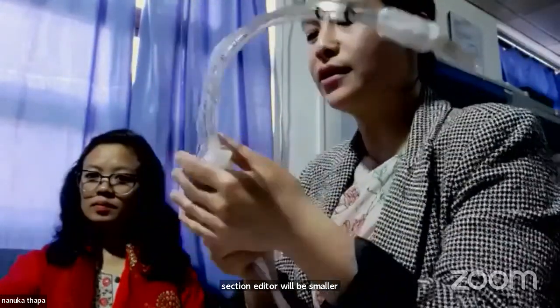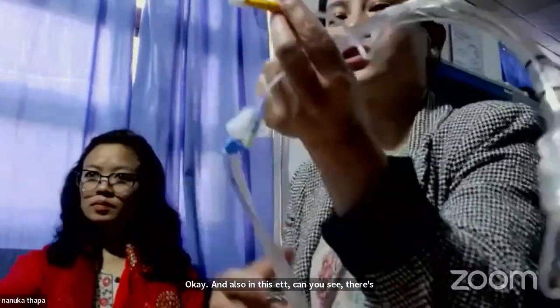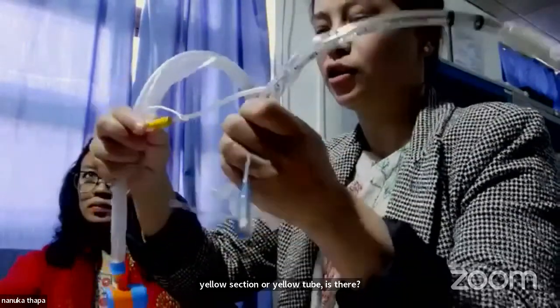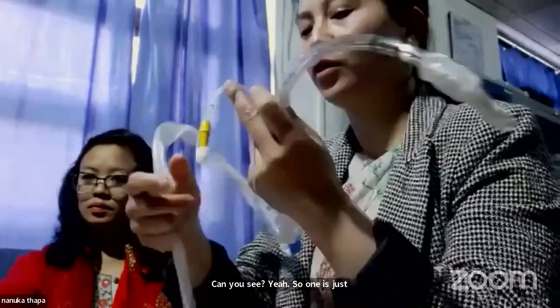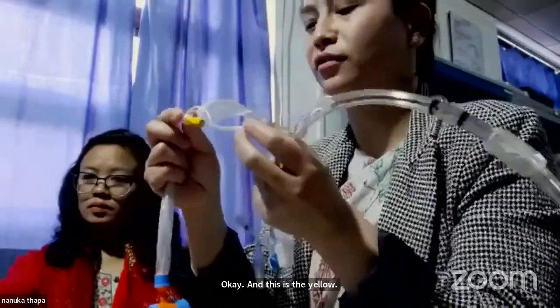And also in this ET tube, can you see, there's another yellow tube. So one is this pilot balloon, this is the tube for the pilot balloon. And this yellow one is for subglottic suction, okay?